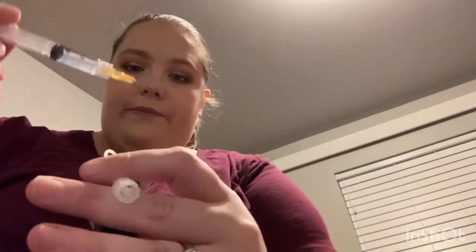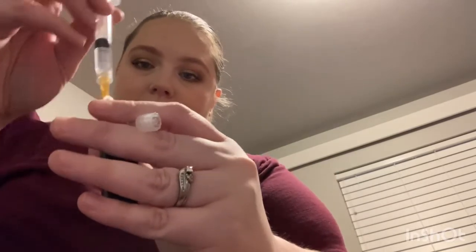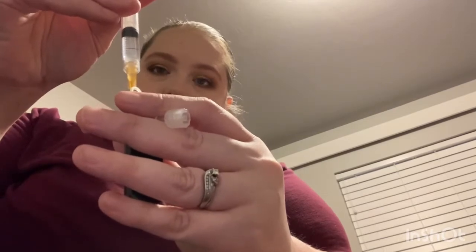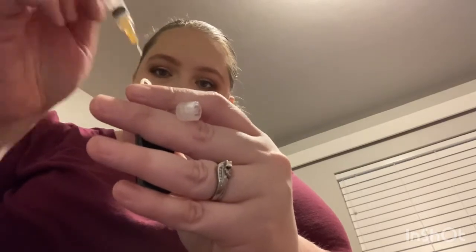Take the reservoir — there's a little white dot that you insert your needle into — and push the insulin in. It fills the whole reservoir cartridge with that amount of insulin. Once it's filled, I cap the needle right away so nobody gets stabbed.